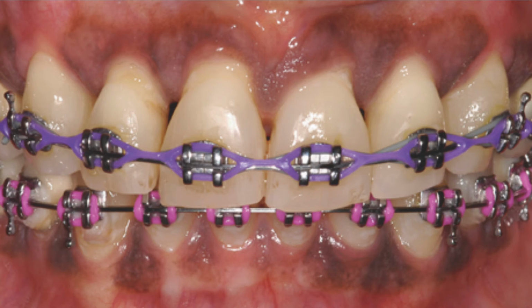Porcelain veneers not only improve the color and shape of teeth, but also can eliminate the dark areas near the gum tissue, which are known as the black triangles. The shape of this patient's upper anterior teeth prevents the gum tissue from completely filling the spaces.